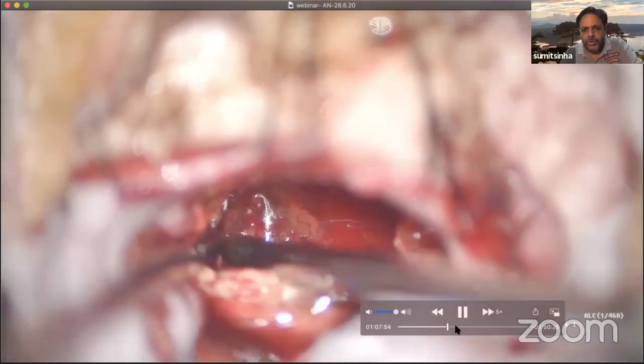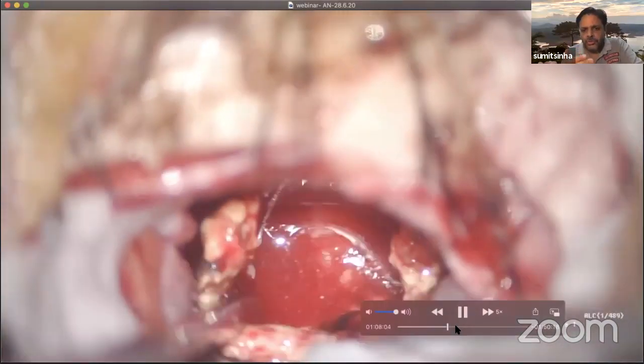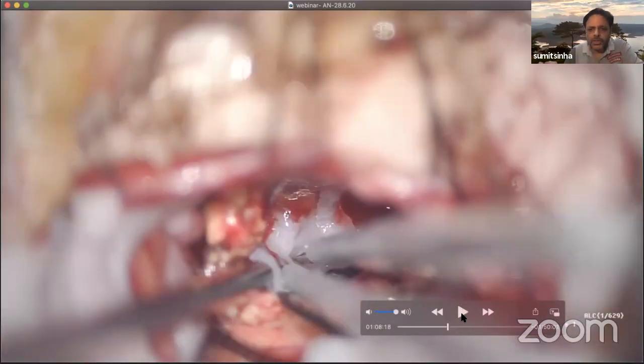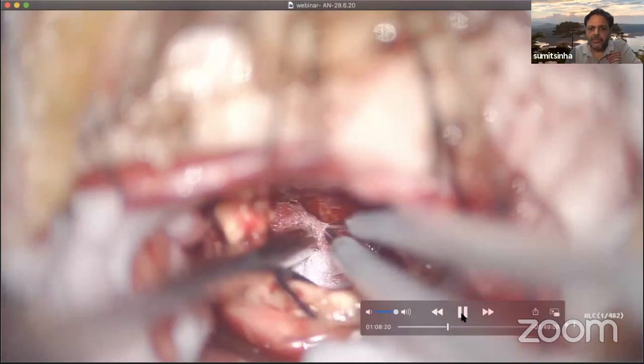So when you debulk and you reach near the tumor capsule, the feeling of your suction through the CUSA changes. This is a feel that you have to experience, and only then can you know about it. When you reach near the tumor capsule, more and more tumor capsule begins jumping into the CUSA. So this is how you recognize that you have reached the proximity of the tumor capsule.